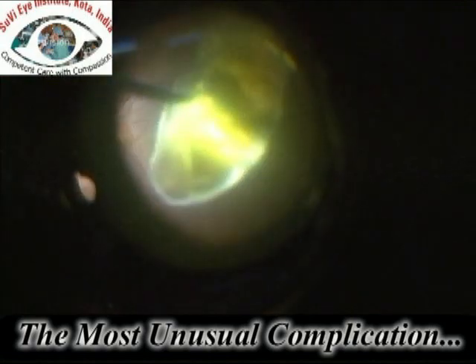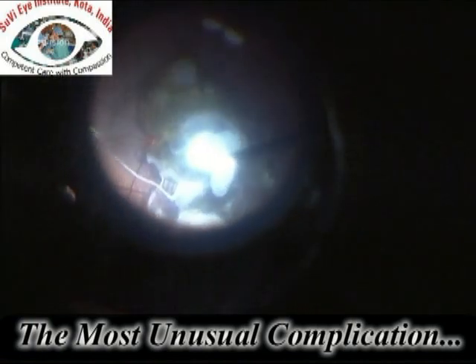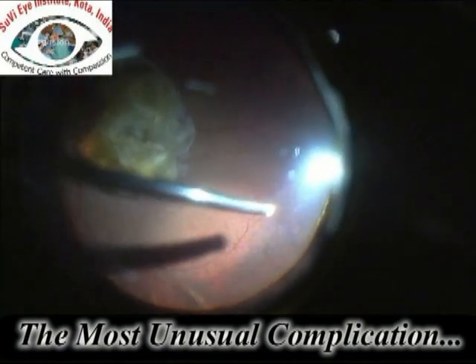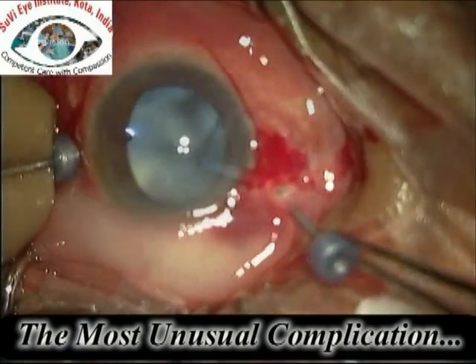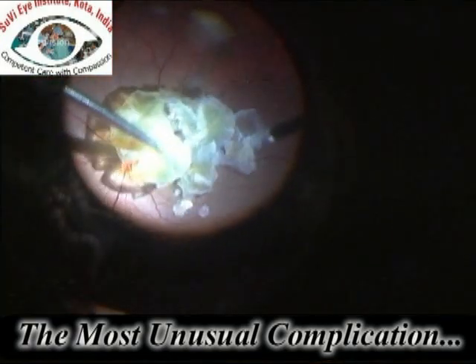We then do the standard procedure to remove the nucleus. This is the vitrectomy being done to clear all the vitreous around the dropped nucleus. Once we have isolated the nucleus, a little triamcinolone is injected around the nucleus to free it completely and remove any further vitreous that may be stuck onto it.